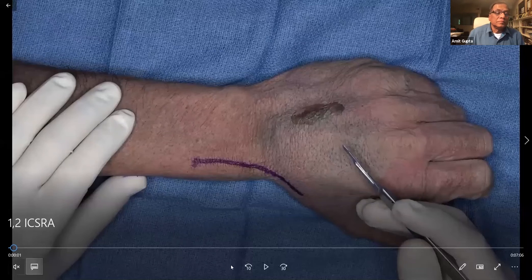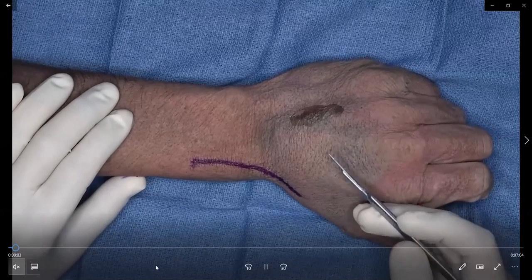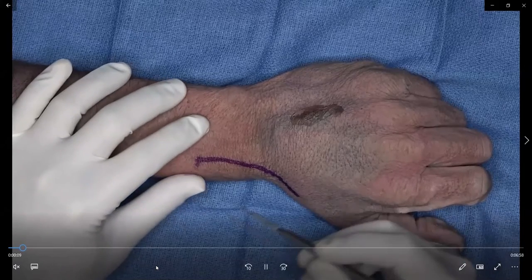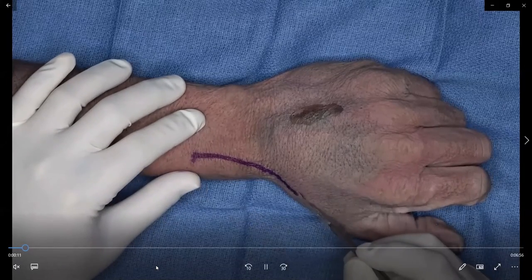Thank you, Amit. Max, can you run the video? This is a cadaveric dissection going over the anatomy and harvesting of the 1-2 ICSRA flap. Typically this is done with a curvilinear incision going from the dorsal aspect of the radius over the second compartment, extending obliquely across the wrist joint, ending distal to the scaphoid and at the base of the trapezium.